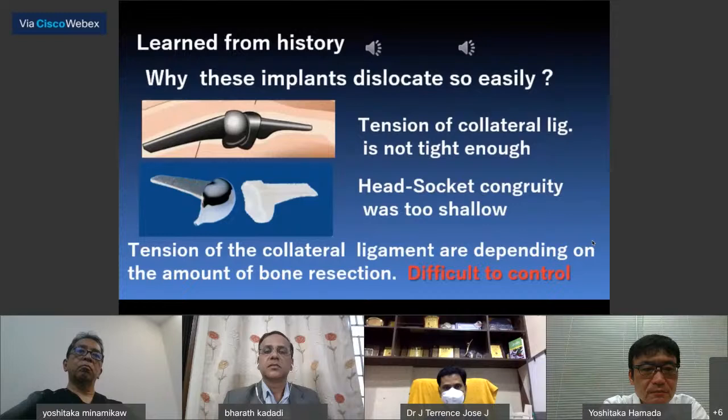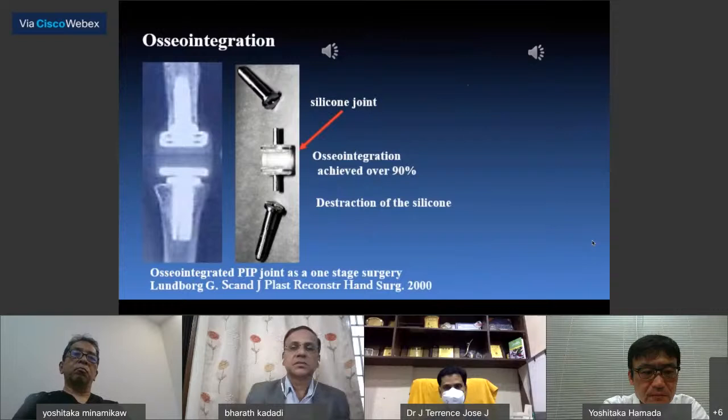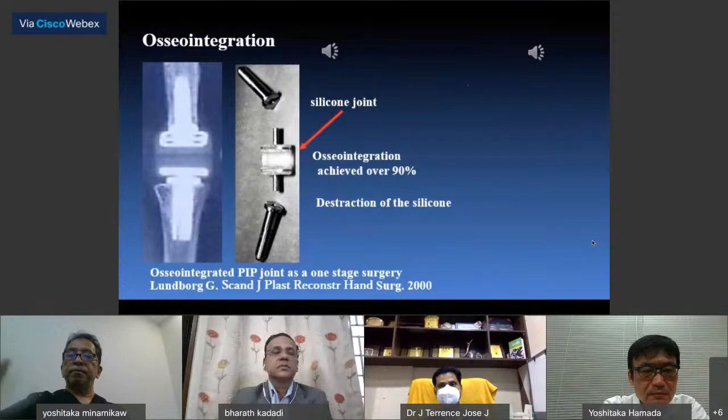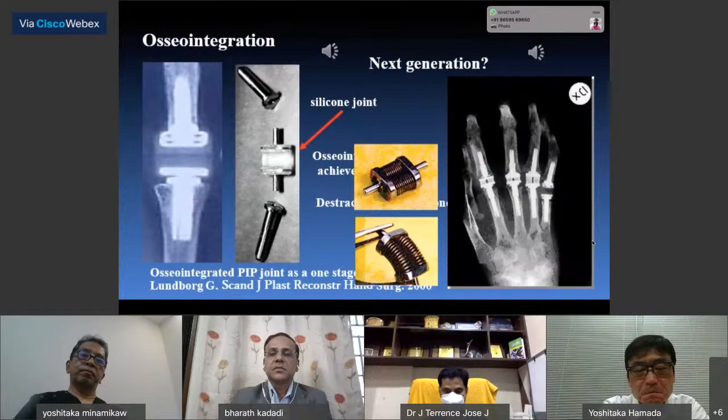Osseointegration using titanium screw by Lundborg. They used both MP and PIP joints and achieved an osseointegration rate over 90%. However, the silicone hinge was broken as expected. The next generation used a twin spring for the joint. Excellent results were reported, but it is not popularized at this moment.